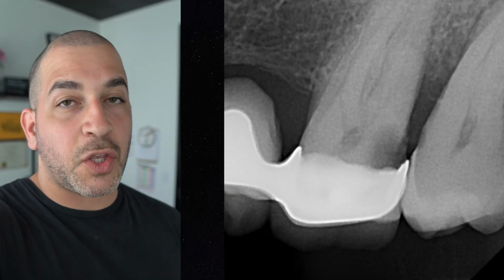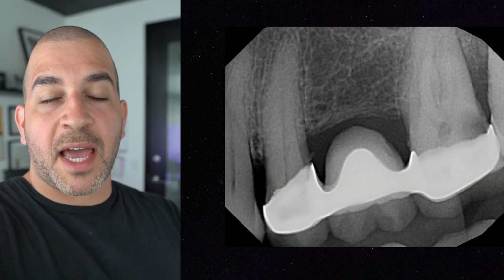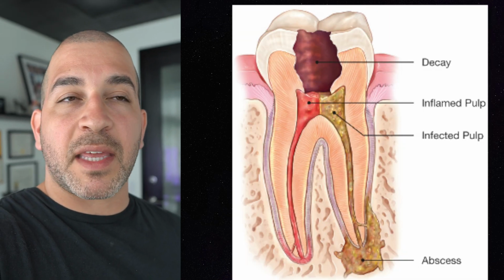If you look at the x-ray, you may tell that this is a large cavity. When we see a dark shadow on the x-ray, that means that it's essentially decayed tooth structure. And if that decay reaches the nerve of the tooth, then you may need something called a root canal. But we don't really know until we remove the bridge and explore how deep the decay is when we're excavating or removing that carious tooth structure.